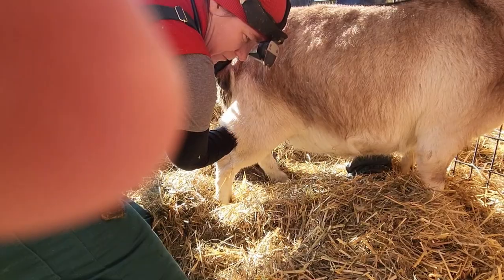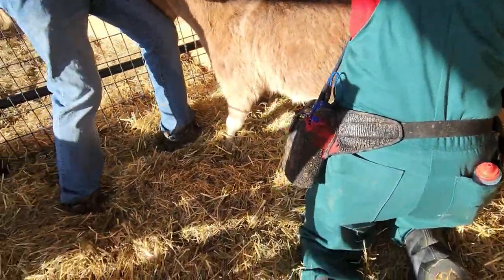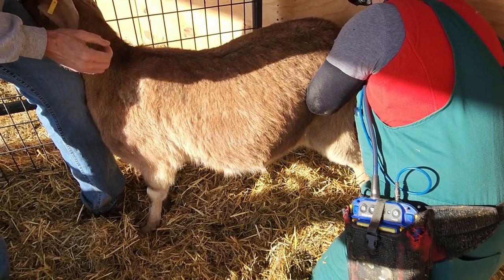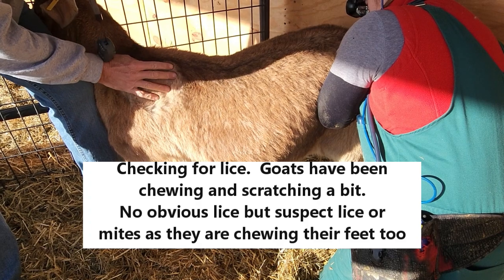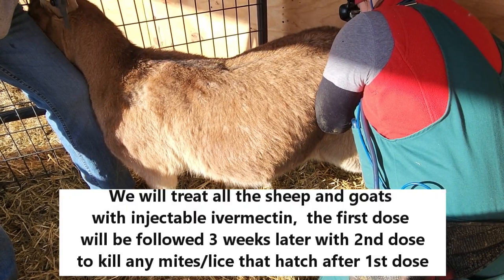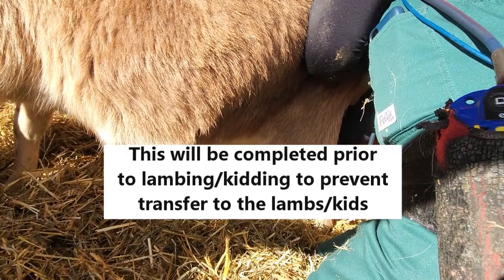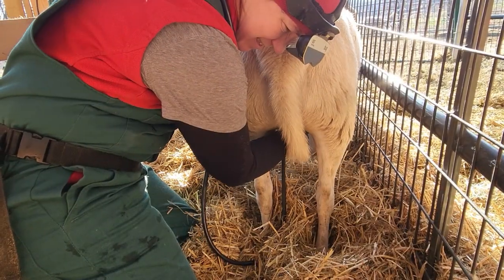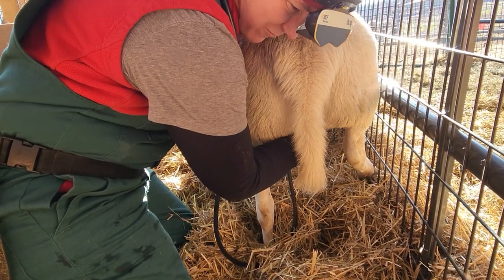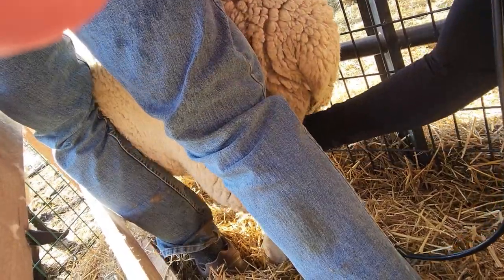2 right next to each other. Pregnant, 2. Pregnant and 2. Pregnant, I see 1. She would be fairly far along. I was going to say she's going to be up there where kind of the goats were. Yep. I'm just seeing 1, but she definitely is on that higher side. 2 on her, and I would say you're about that, like the last one's not.